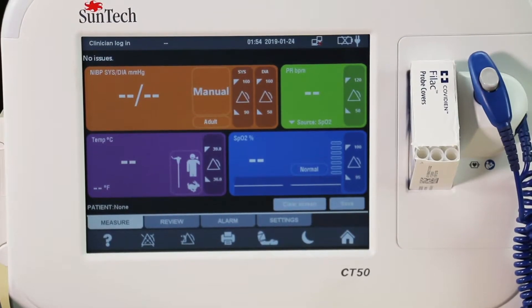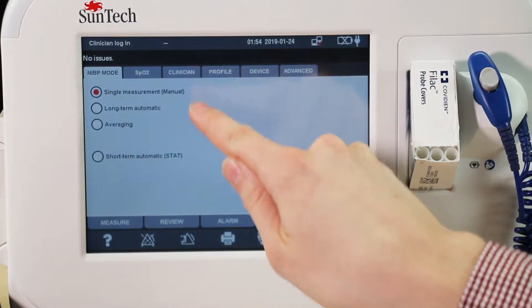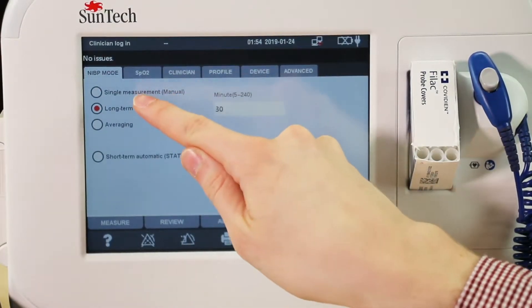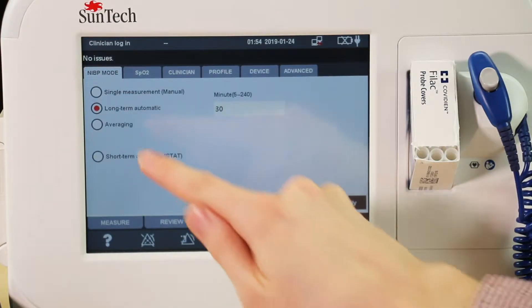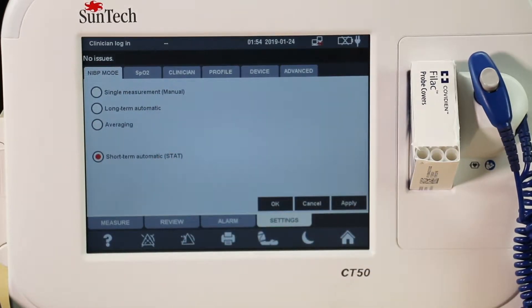The Suntec CT50 monitor can perform in either single, long-term, or average blood pressure mode. Single BP mode is used to take only one measurement. Long-term or continuous BP mode will measure at intervals for a set time. Averaging BP will take a number of measurements and average them together. Stat mode will continually take BP measurements until you press the blood pressure icon.